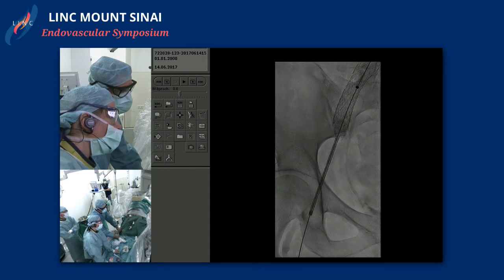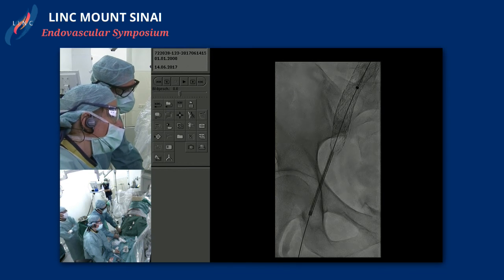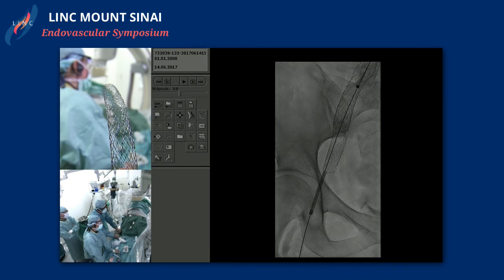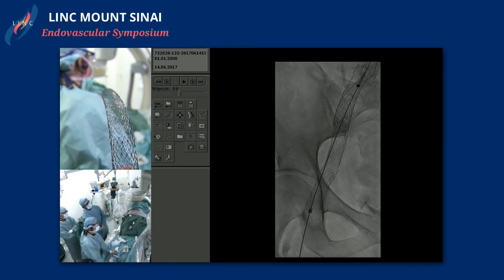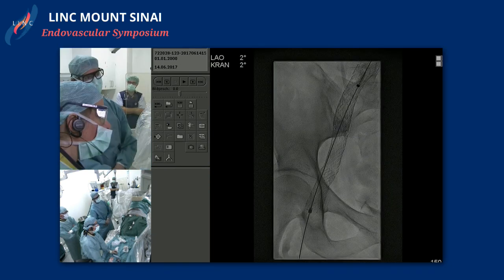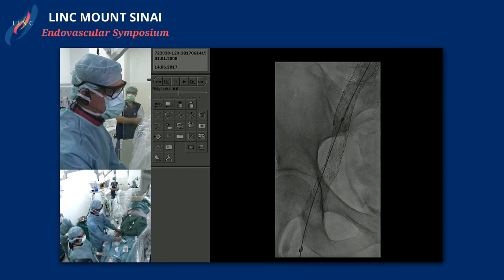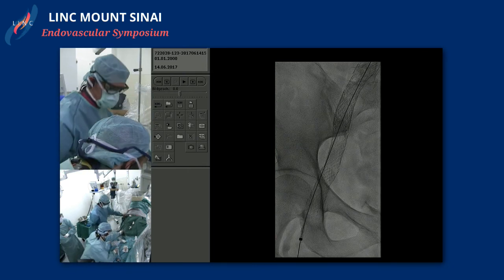So clearly you're not allowed to pull on that stent because then it gets elongated. And only by this slow implantation does it remain in that morphology and form which you want to have. But that I think looks already quite nice. I agree. That looks like you placed it perfectly.